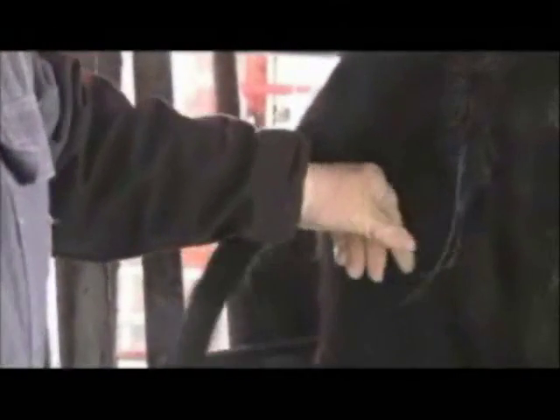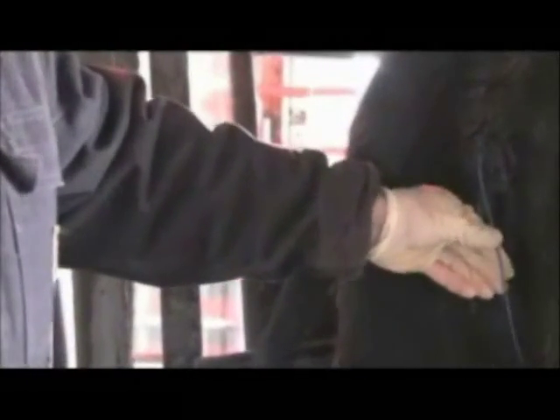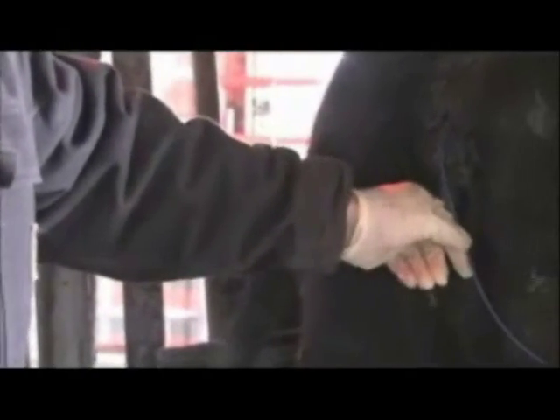and insert the CIDR and applicator at an upward angle, ensuring that the tail of the CIDR is pointed down. Insert the applicator until resistance is felt. Depress the applicator trigger and slowly pull the applicator back out. Again, ensure that the tail of the CIDR is facing down to minimize the chances of the CIDR being pulled out during the estrus synchronization protocol.